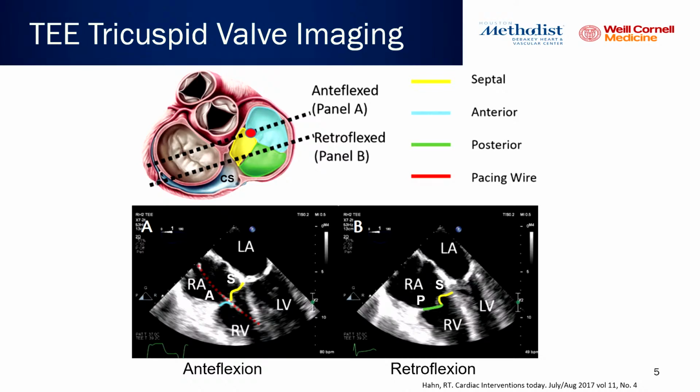And when you are not seeing the CS, or you start seeing, for example, the aortic valve, when you're really shallow in the esophageal views, you see the anterior and the septal leaflets. And this is very important, not only to understand where this jet is coming from, but also to plan your procedure and build your strategy when you're sending a patient for a tricuspid clip.